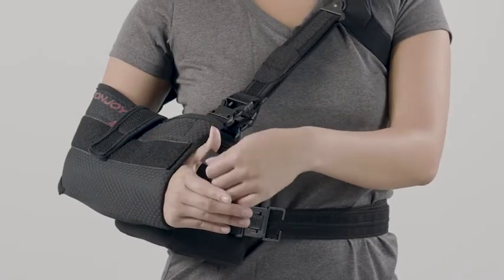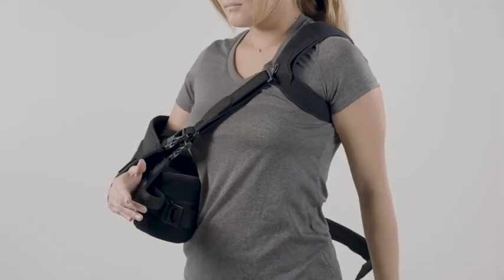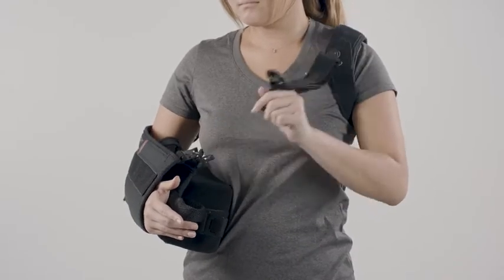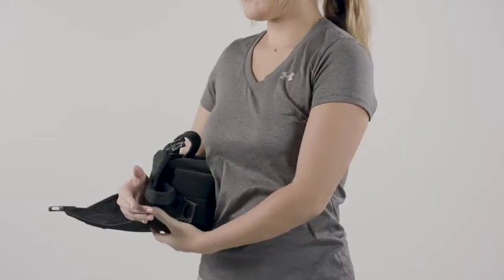To remove the Ultra Sling Pro, remove the forearm and thumb straps. Release the waist belt quick release buckle at front of cushion. Disengage the quick release buckles at front of arm sling. Slowly remove brace by lowering the pillow and sling below hip.